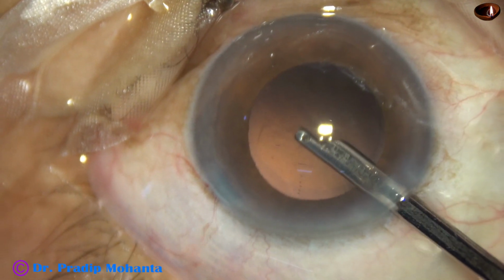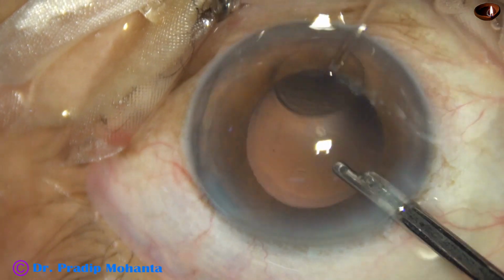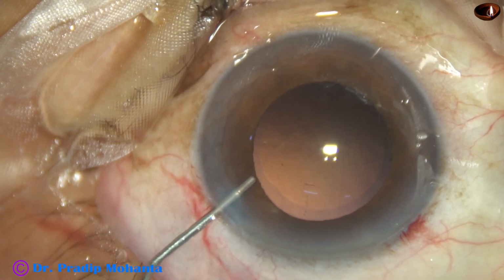But here I see a rent. Probably it occurred during aspiration of the cortex.